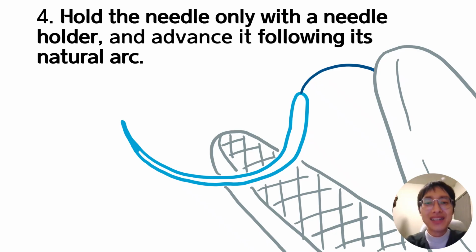Okay, let's go the easier way. Let's use the needle holder, as it means. Okay, use a needle holder. Using a hemostat is also kind of okay, but it is not as comfortable as a needle holder.